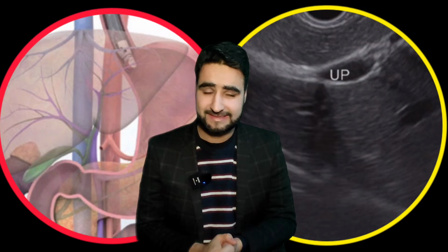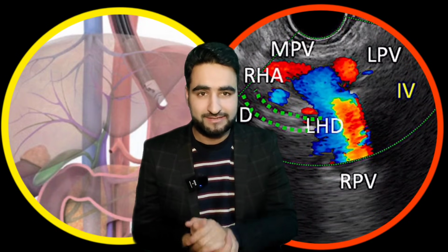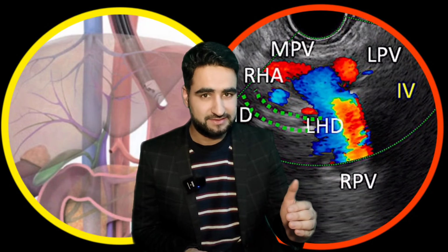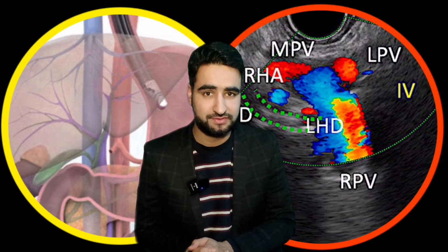Our next destination is the hepatic hilum. You will gently push your echoendoscope with a slight clockwise rotation. What you will see at the hilum is, superiorly, that is the right side of the screen, the main portal vein dividing into right and left portal veins. Inferiorly is the main portal vein continuing its course.